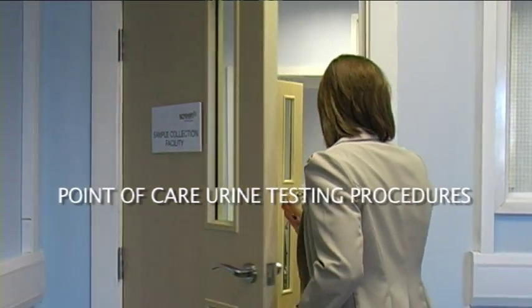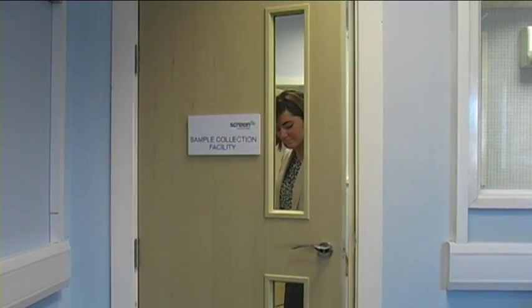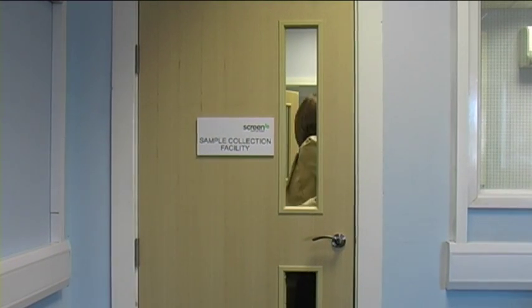Point-of-care urine testing procedures. The testing facility will have been prepared to ensure both oral and visual privacy. On arrival, the donor will be introduced to the collection technician, who will produce their photographic identification and in turn ask to see the donor's identification. Thank you. Well, I'm just going to write your details down.